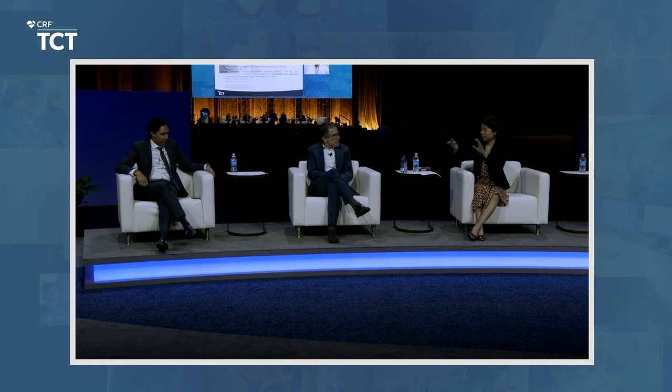Yeah, as I explained originally, it's a small accumulation of small fragments. Each individual calcium is not super thick, it's small. So as long as you disrupt them, they get disrupted again and then redistributed. You just push it out of the way. Yeah. But here's the complicated part: only two-thirds of them are like that. Oh, wait a second. I think all of the defined calcified nodules should have the same structure inside, so all of them should be small fragments. However, out of those, two-thirds can be disrupted, but one-third didn't. But that does not mean the calcified nodule is a different pattern, just still a little bit harder compared to the other.